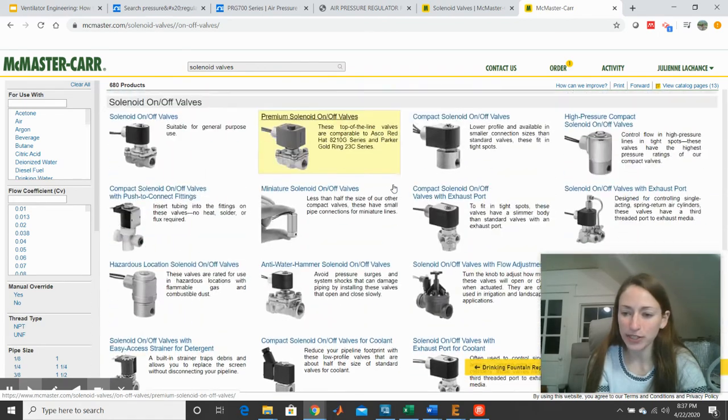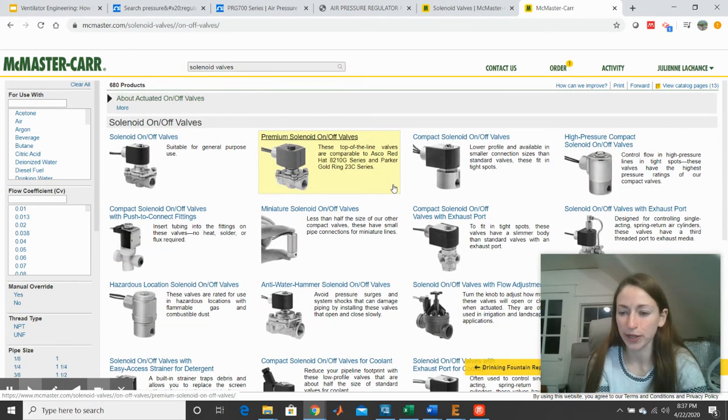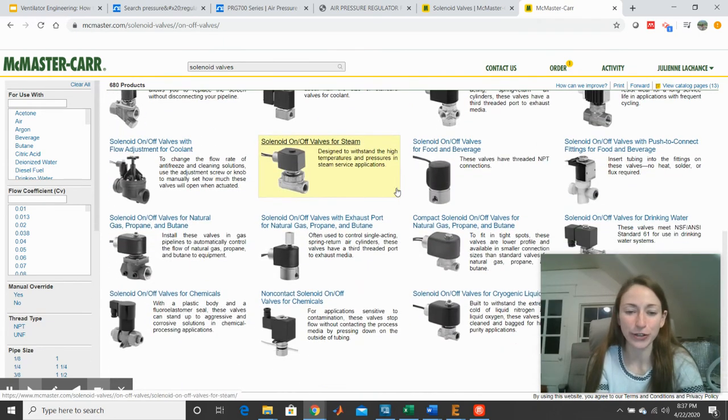So these process valves are typically used for moving around process fluids. If you're in the food and beverage industry, this may be moving around milk, right? So if we scroll down to the bottom here, we see a bunch of different process valves for moving things like chemicals, cryogenic liquids, drinking water, gas, and so on.